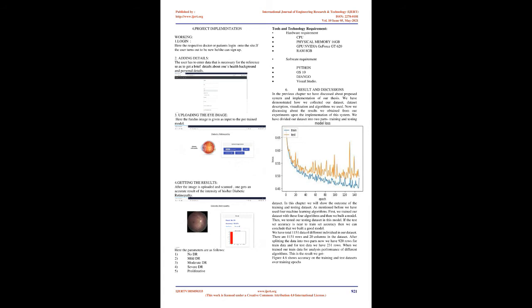Model specification. We have used 3 models for obtaining greater accuracy. The 3 models are as follows. 1. CNN. CNNs have broken the mold and ascended the throne to become the state-of-the-art computer vision technique. Among the different types of neural networks, others include recurrent neural networks (RNN), long short-term memory (LSTM), artificial neural networks, etc. CNNs are easily the most popular. CNNs are used for image classification and recognition because of their high accuracy.